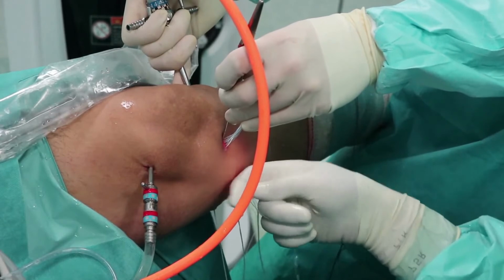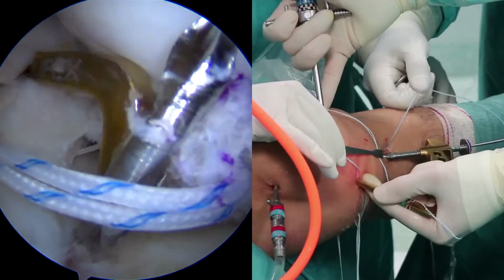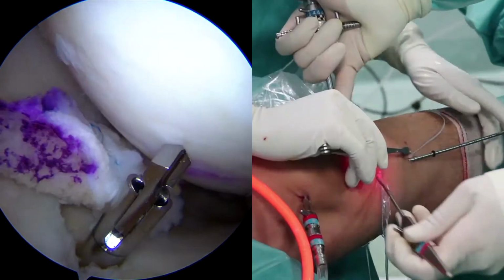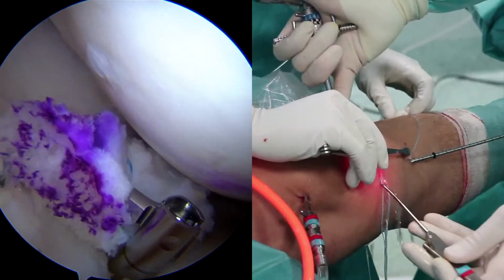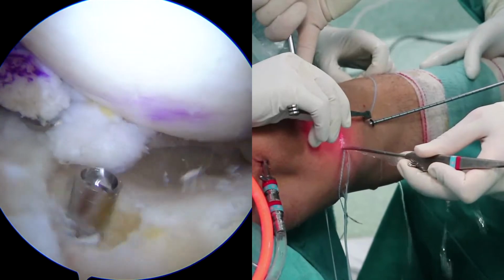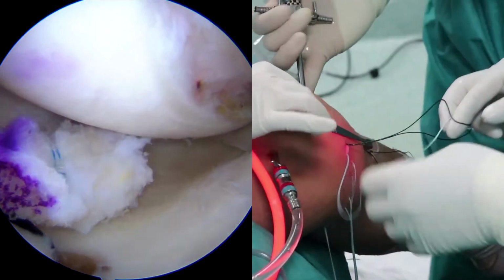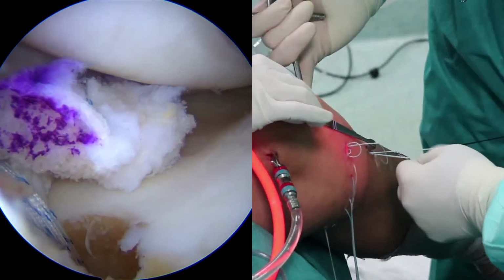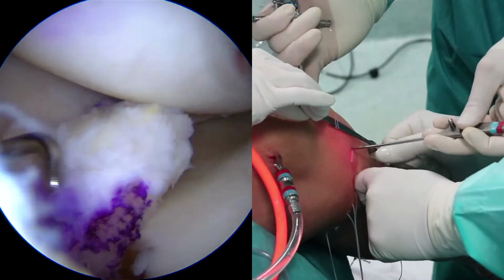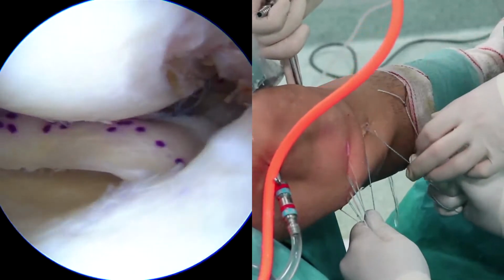The next step in the surgery will be to create the anterior tibial tunnel. This tunnel can be done at the beginning of the procedure, but we prefer to do it after all the body sutures are extracted because it gives us an exact idea where it is related to its anatomic location. Ideally, it should be positioned in front of the tibial insertion of the ACL and behind the intermeniscal ligament. Technically, the same steps that were used to create the posterior tunnel are repeated, with caution, as this tunnel is much shorter and very anterior.